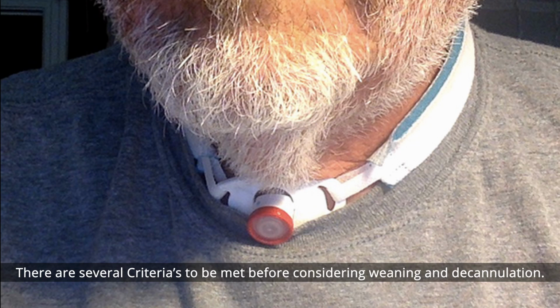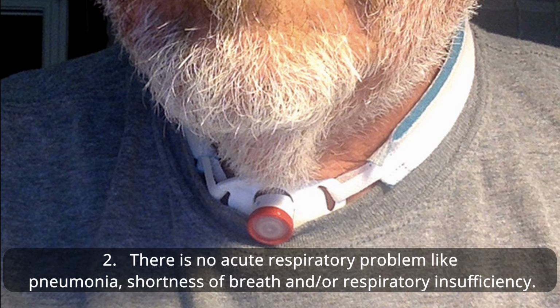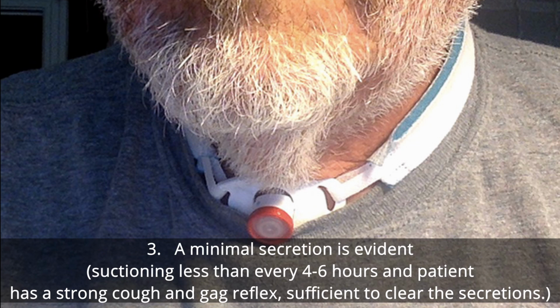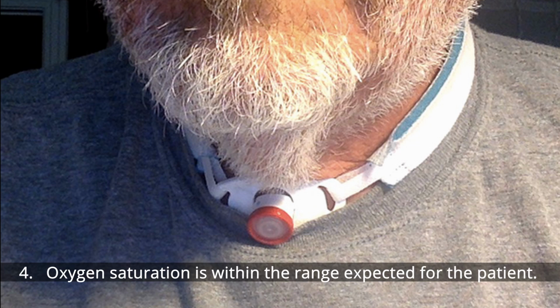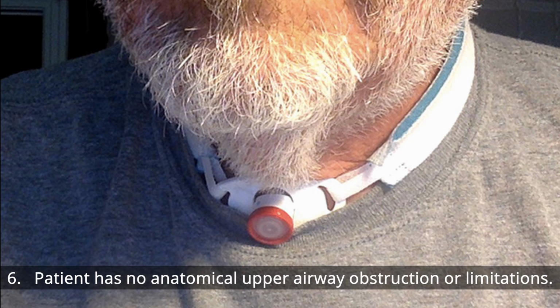There are several criteria to be met before considering weaning and decannulation. The first, the reason for tracheostomy should be resolved. There is no acute respiratory problem like pneumonia, shortness of breath, and respiratory insufficiency. Minimal secretion, usually they will tell less than 4 to 6 hours needed to be suctioned. A strong cough or gag reflex, sufficient to clear the secretion. Oxygen saturation is acceptable. Patient is not on mechanical ventilator for more than 48 hours. The patient has no anatomical upper airway obstruction or limitations.